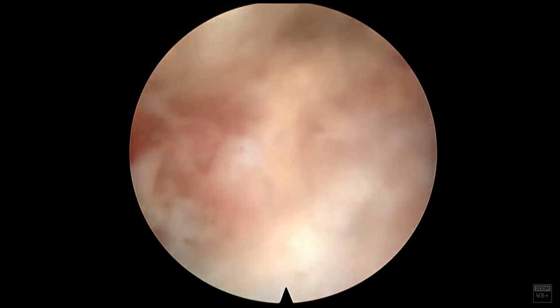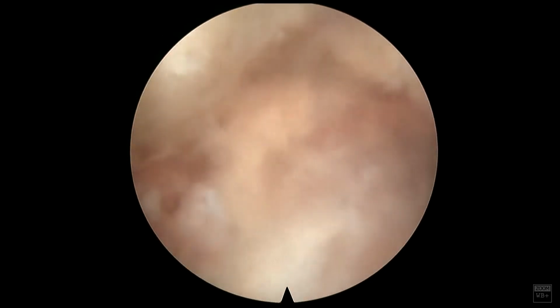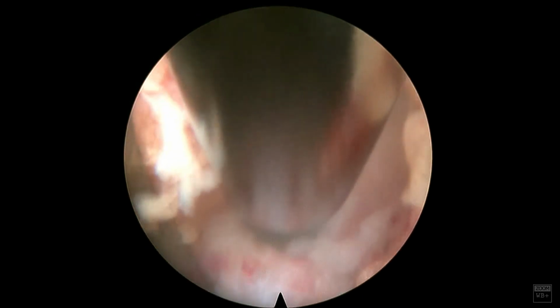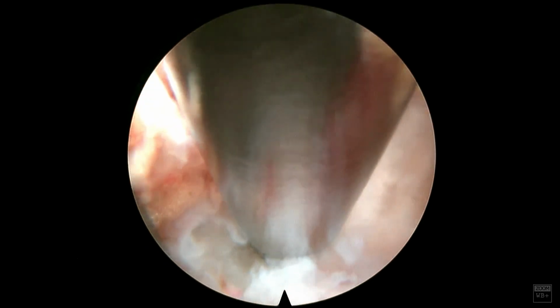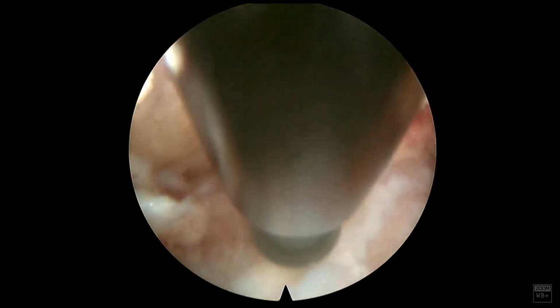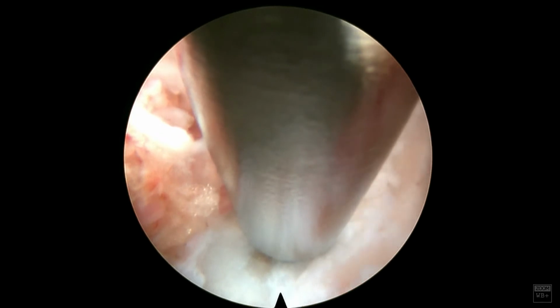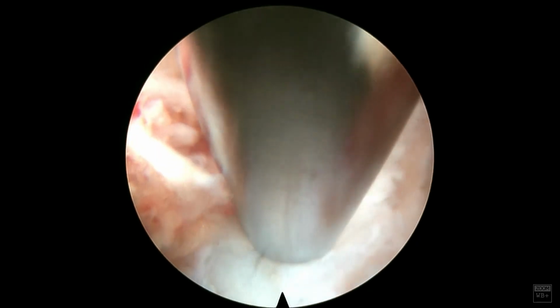because you always want to keep the working tube where you can recognize the anatomical structures and know where you're at. So you can see here we're getting more of the annulus fibers. The disc is pretty chalky, and that's what I'm removing with the diamond burr here. I am in a disc space here. I'm taking fluoroscopic shots at the same time that you can't see, but I'm checking my depth, just to annotate that I'm in a disc space, and two, making sure that I do remove enough of the disc space, just to have a good thorough decompression.